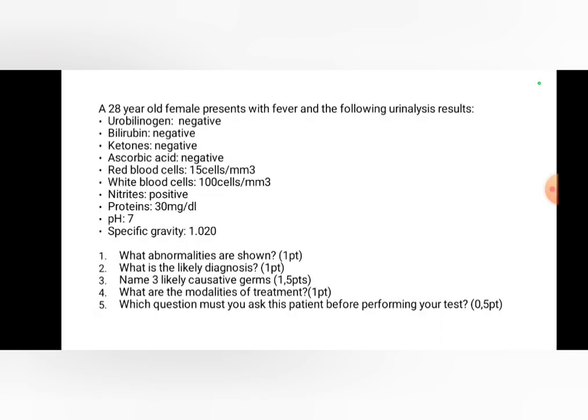Now, the ascorbic acid is just vitamin C, and if you have taken vitamin C, you are going to have a high level of ascorbic acid. So it's not going to be of high interest. Is it clear? But ascorbic acid can also be more in favor of urine stones. Is it clear? Because a high ascorbic acid level in urine promotes the formation of urine stones. So if you think of a diagnosis of urinary stone and you visualize ascorbic acid, it can go towards your urinary stone.